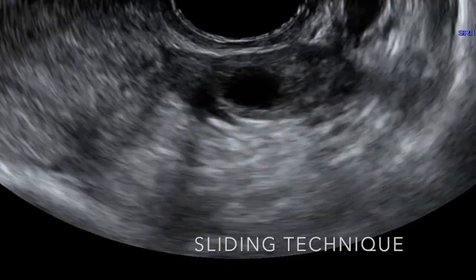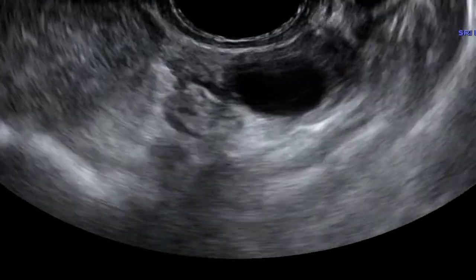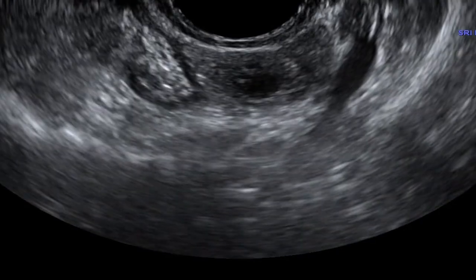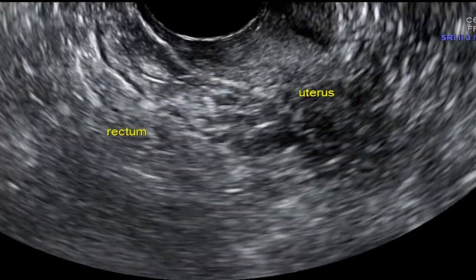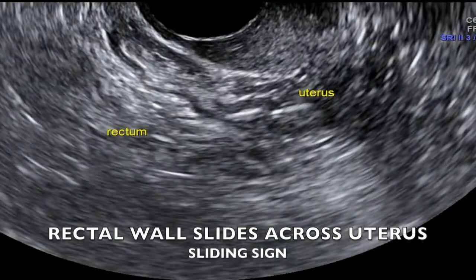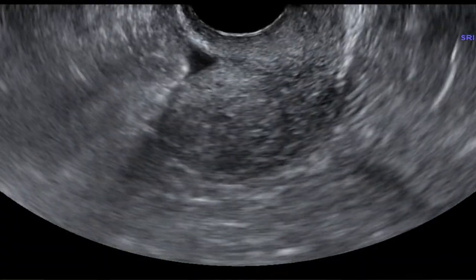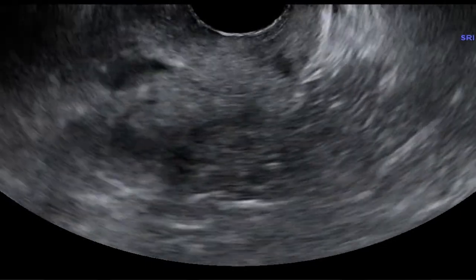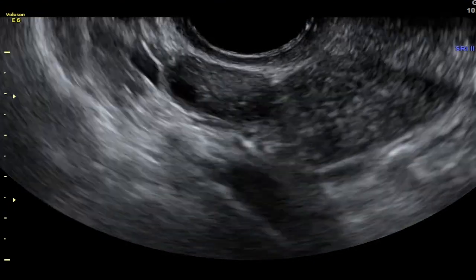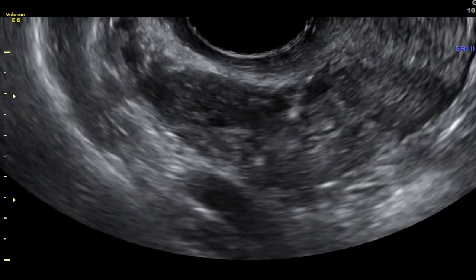The third tip is the sliding sign to assess POD lesions. As we push the probe inwards gently and pull it back, you can see the ovary separating from the rectal wall, allowing you to determine clearly whether the ovary is adherent to it. In this technique we see whether the anterior rectum is gliding freely over the posterior aspect of the uterus and cervix. A normal sliding motion is regarded as a positive sliding sign, and it is very important to diagnose POD lesions and adhesions at the pouch of Douglas. It also allows us to evaluate the rectal wall and look for rectal nodules that would otherwise be missed. Performing the sliding sign is a must when evaluating for endometriosis.